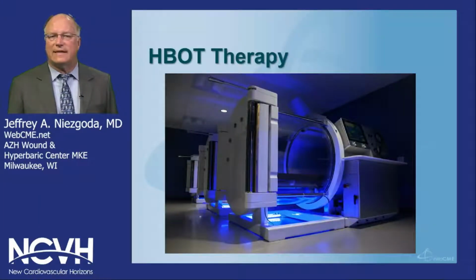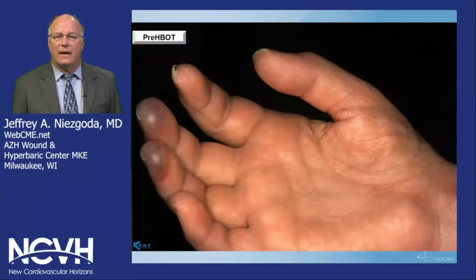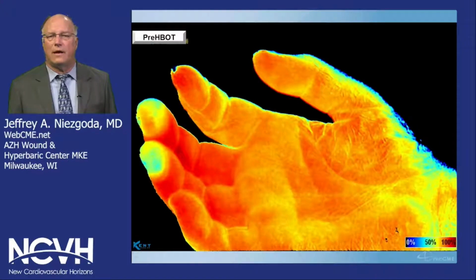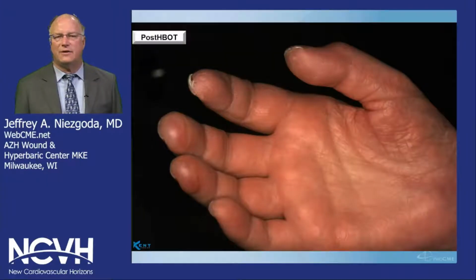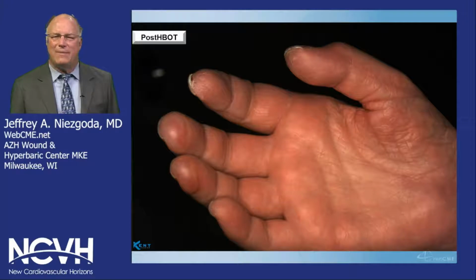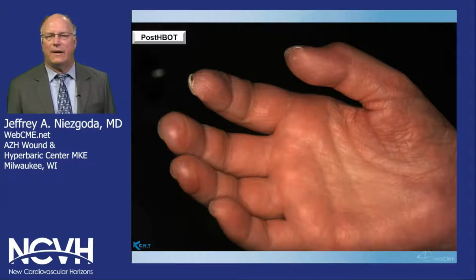You've used it extensively in hyperbaric therapy. Here's an example. This is a patient with some frostbite. You can see those dusky tips of the digits, digit 3 and 4. Pre-hyperbaric, it correlates very well with the camera, again, showing those blues and greens at those fingertips correlating with the tissue demarcation. Do we make a difference in hyperbaric? Well, here the patient comes out of the chamber, post-hyperbaric and RGB image. Yeah, maybe we do see a little bit of improvement, but I'm not really sure.